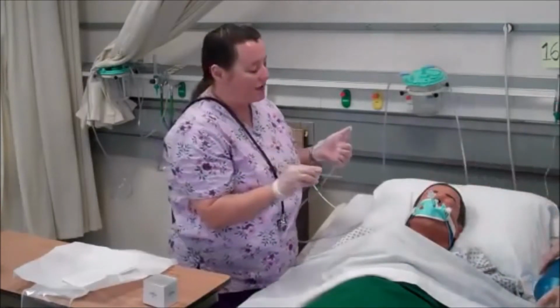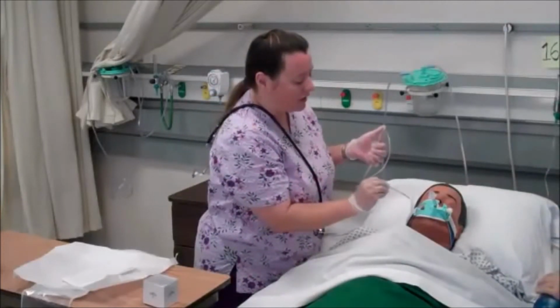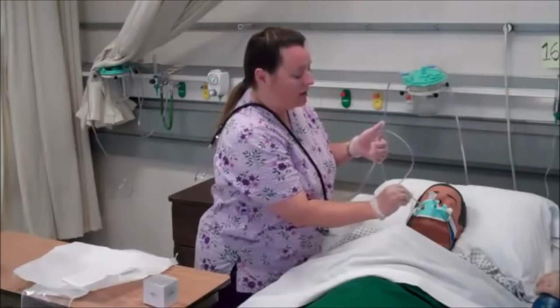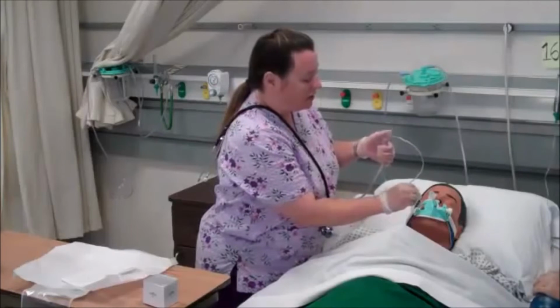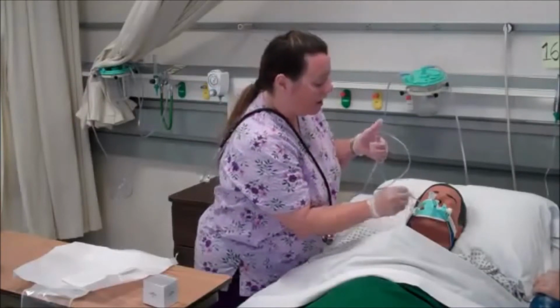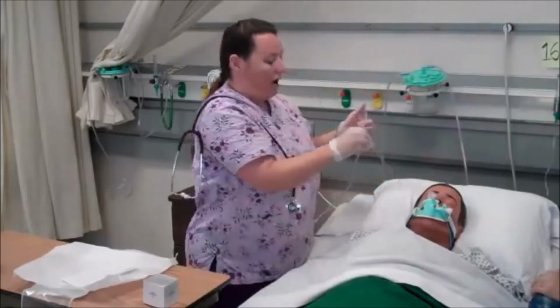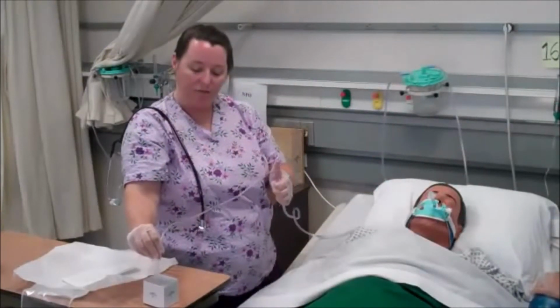Now I want to go ahead and assess my patient's oral mucosa to see if it would warrant any kind of suctioning of saliva and secretions inside. Again, same thing. Now it's a clean procedure. The oral cavity is not a sterile cavity. Intermittent suction as I go around the oral mucosa here. Again, I'm going to clear my tubing before I end my procedure.